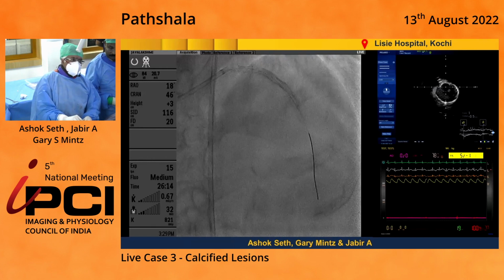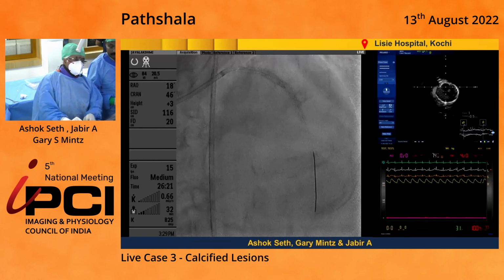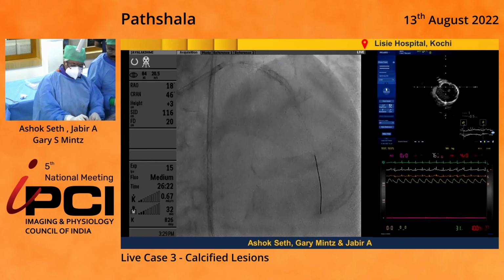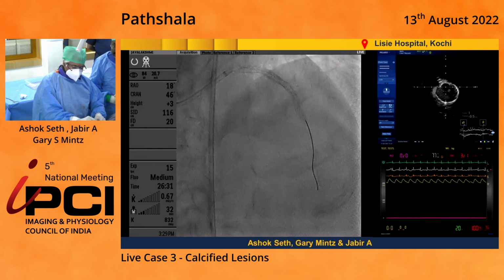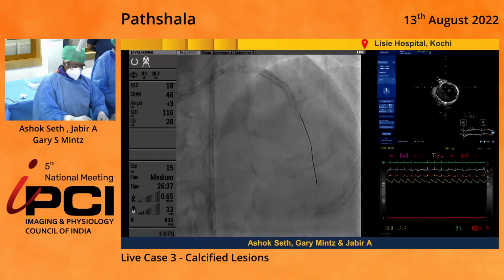No, the 2.75 Onyx would go to a 3.75. Because if you look at where it is, it's right where the overlap is. And I always think of these like a belt buckle, right? And it's metal, so no matter how much you inflate, it just recoils right after.